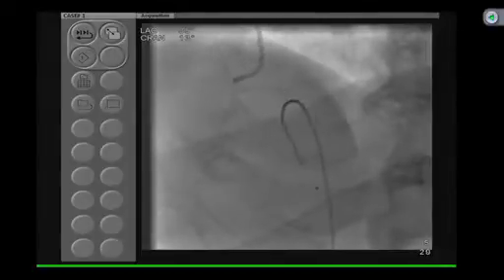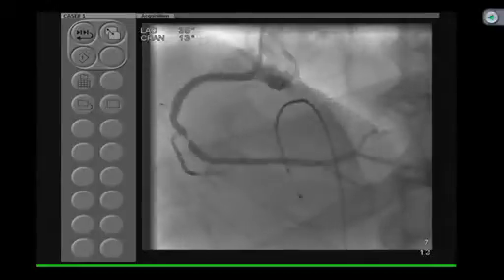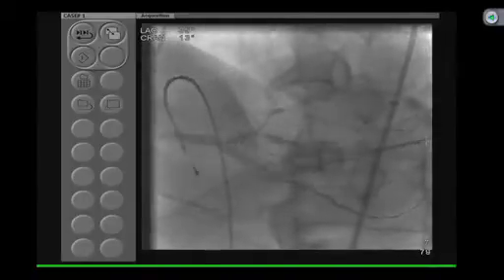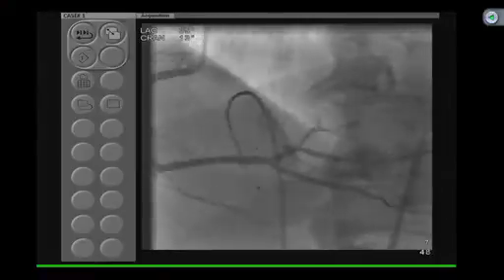There is a stent in the RPL and the proximal RCA stent. So, this is how the angiogram looks. The proximal RCA stent looks okay. Then after the RV branch there is, angiographically, mild calcium, but significant disease there.